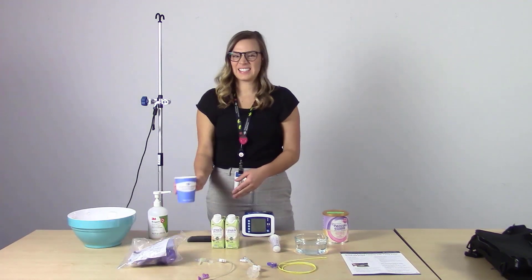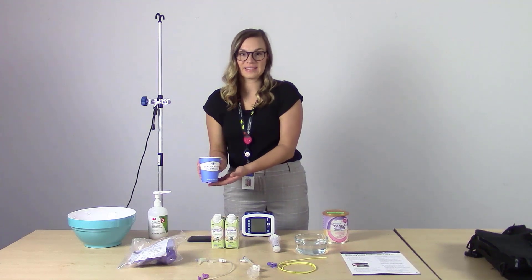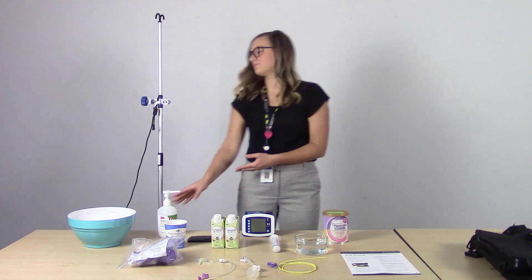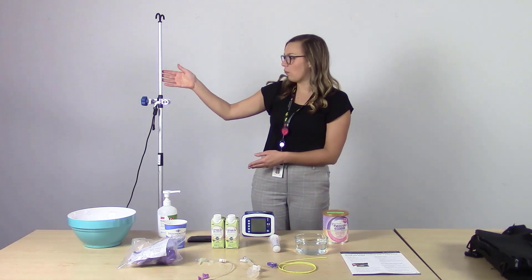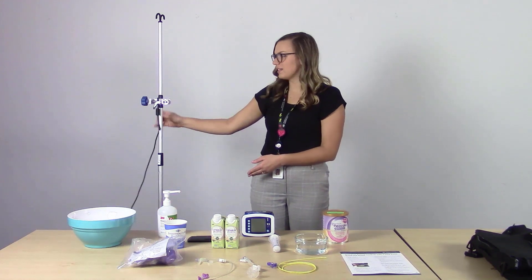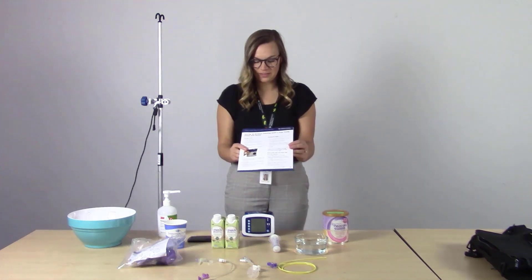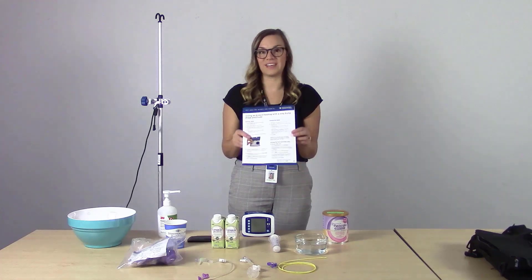You may be near a sink or something with running water to rinse out the bag set if necessary, hand sanitizer, the IV pole with the pole clamp attached, as well as the charger, and this helpful sheet about how to give an enteral feeding with the Joey Pump Feed and Flush Set.